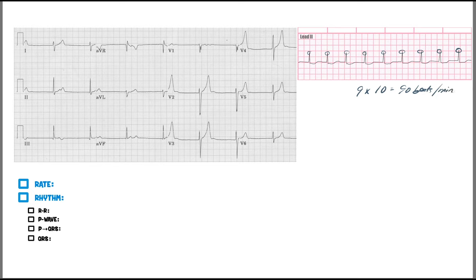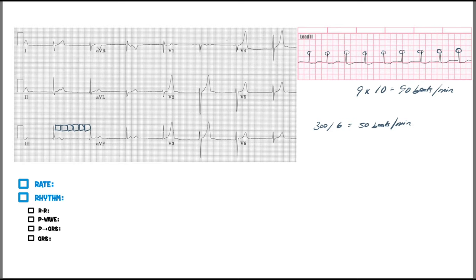Now let's look at this one down here using the box method. We'll look at lead three and go with this R wave — it's pretty close to the line. Marking the boxes: one, two, three, four, five, six — a tiny bit more than six boxes. Take 300 divided by six boxes, that's 50 beats per minute.